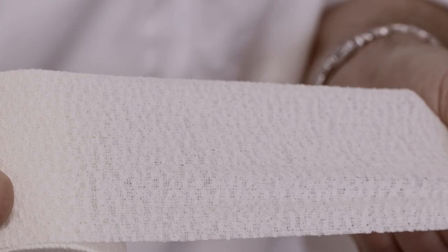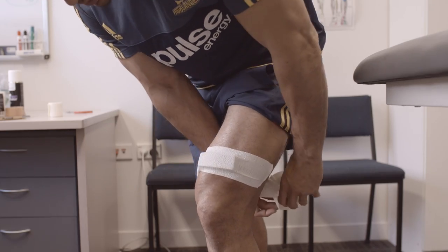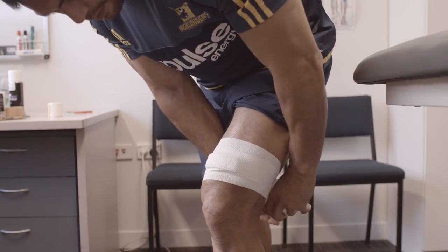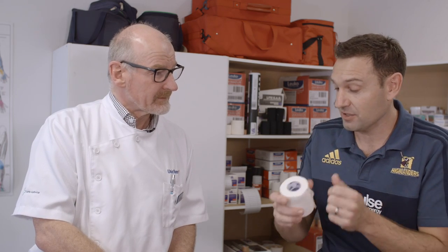So this is the light EAB? Yeah it is. Light EAB or elastic adhesive bandage — there's a lot more stretch and it's also tearable, so you can tear it like that. That makes it really useful in rugby for using it to put on lifters for line out time. It's also good for putting bandages on cuts during a game, so you can put the bandage on and then wrap it around and use it like that.